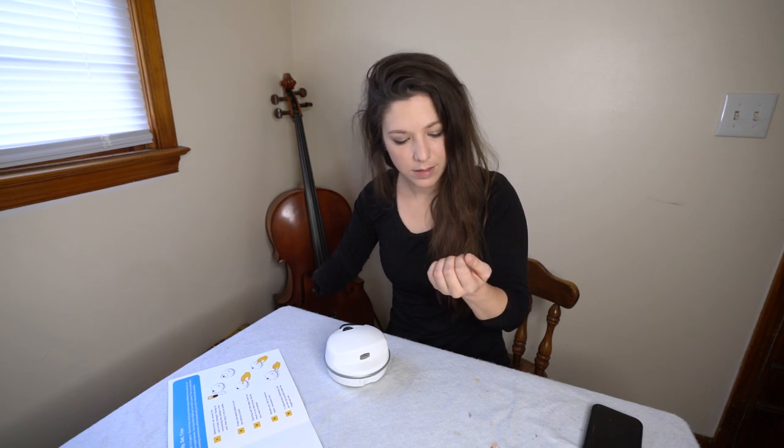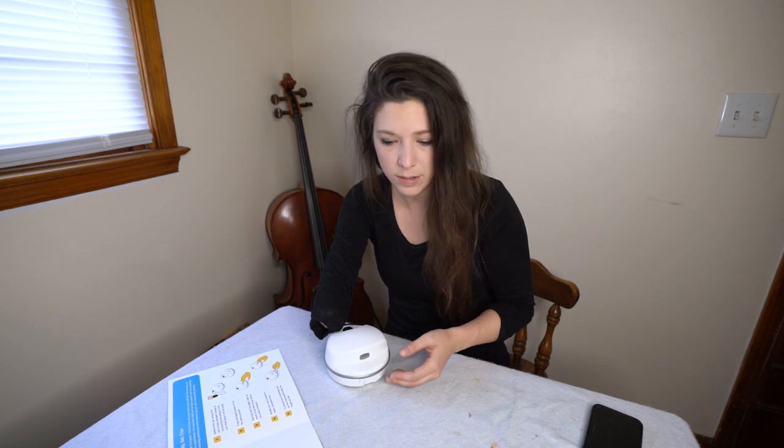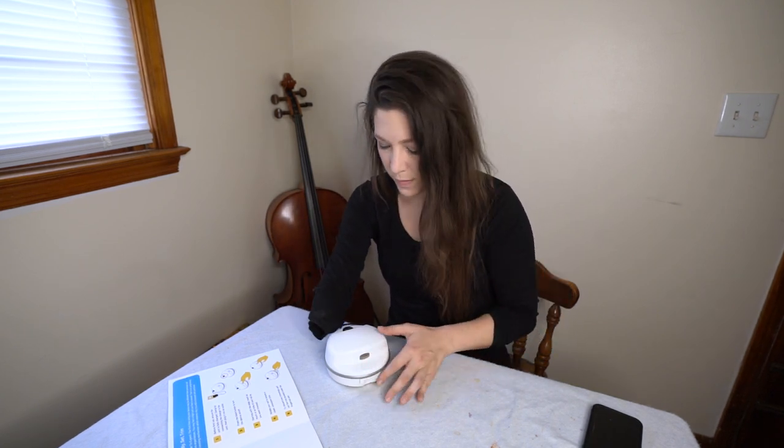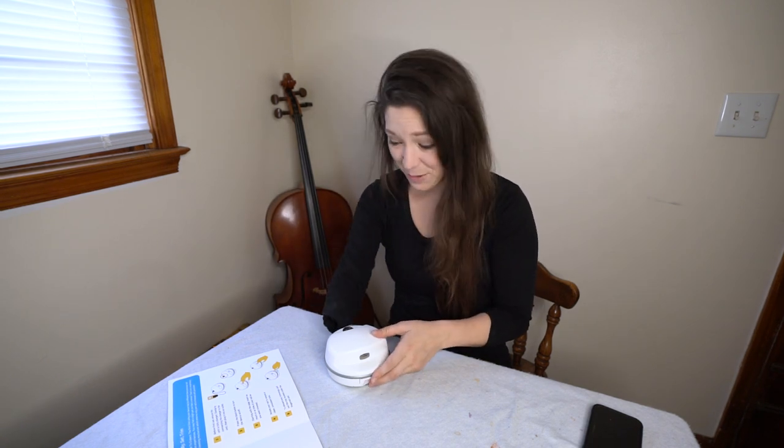That was my first time using this obviously, so that probably took me longer than it will once I'm used to it. That took me maybe two minutes, and I imagine once I'm used to it, it'll be like 30 seconds and I'm done — that's like a quarter of the time it usually takes me. And doing it the old way is kind of cumbersome. Wow, that was cool.